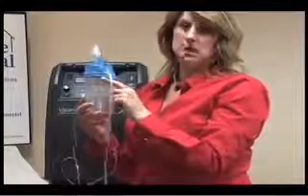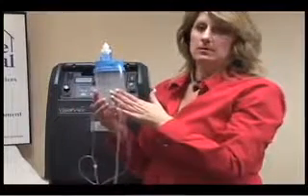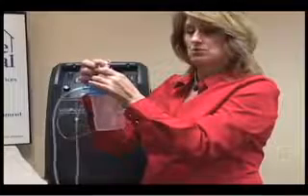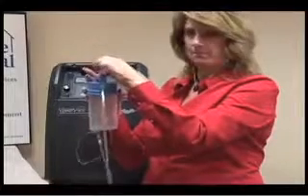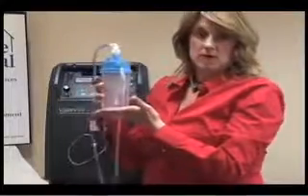Sometimes this causes problems because you do not have it threaded properly, and therefore you will not get your bubbling from your humidifier bottle. Also, with the top of the humidifier that goes to the concentrator from the tubing, you have to make sure that this is also threaded on properly. If this is all properly threaded on, you will get bubbling in your humidifier bottle through your water.